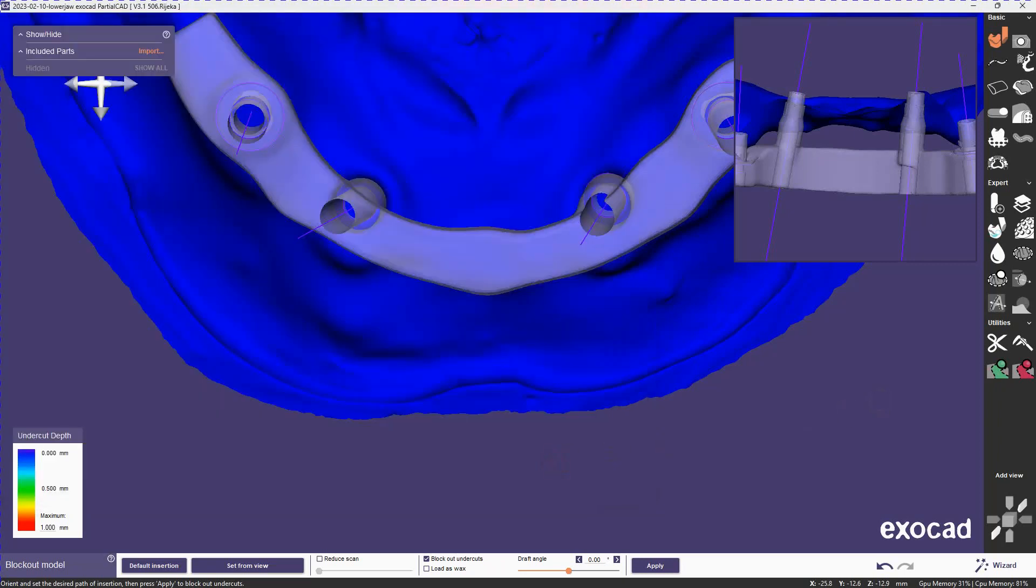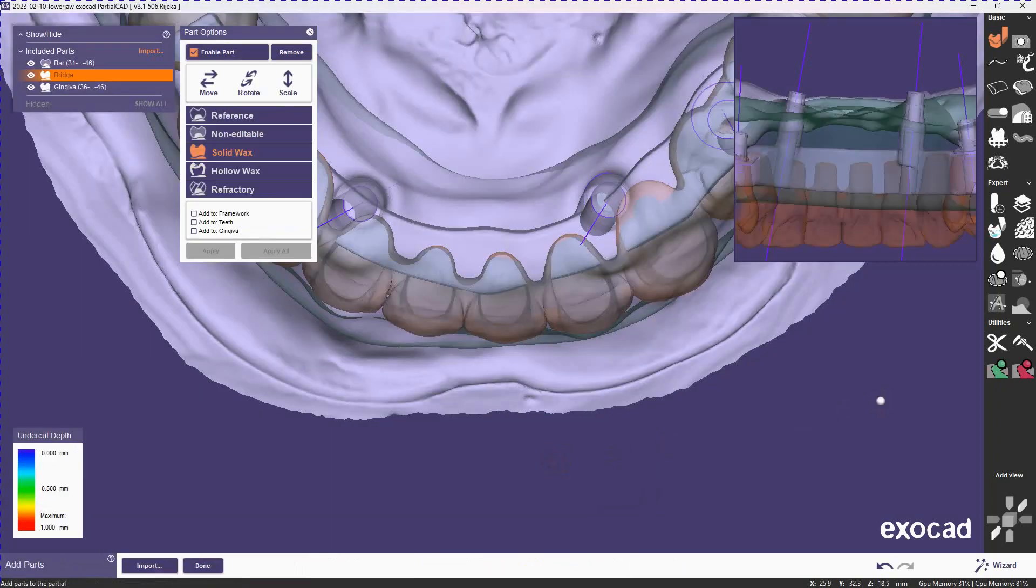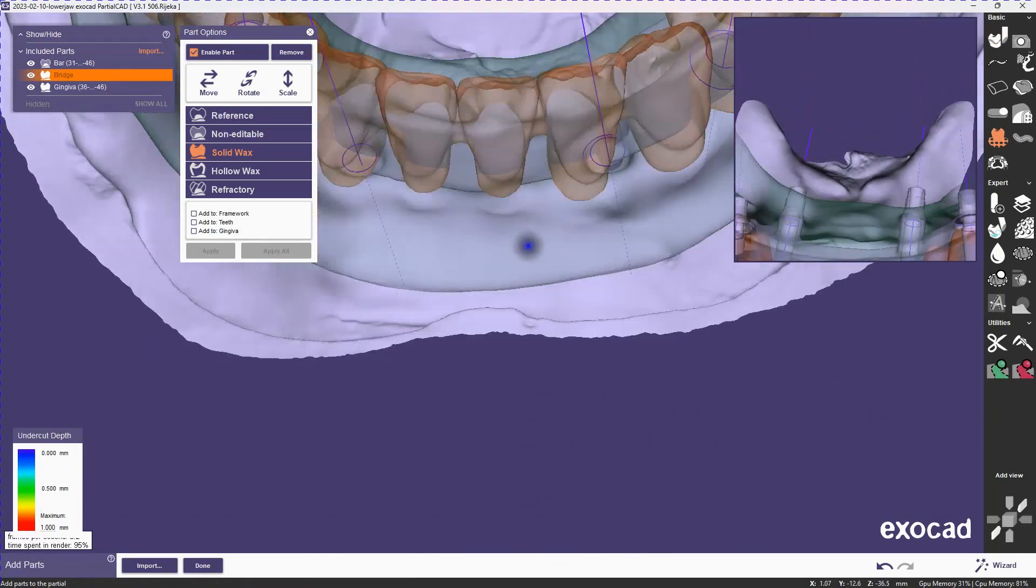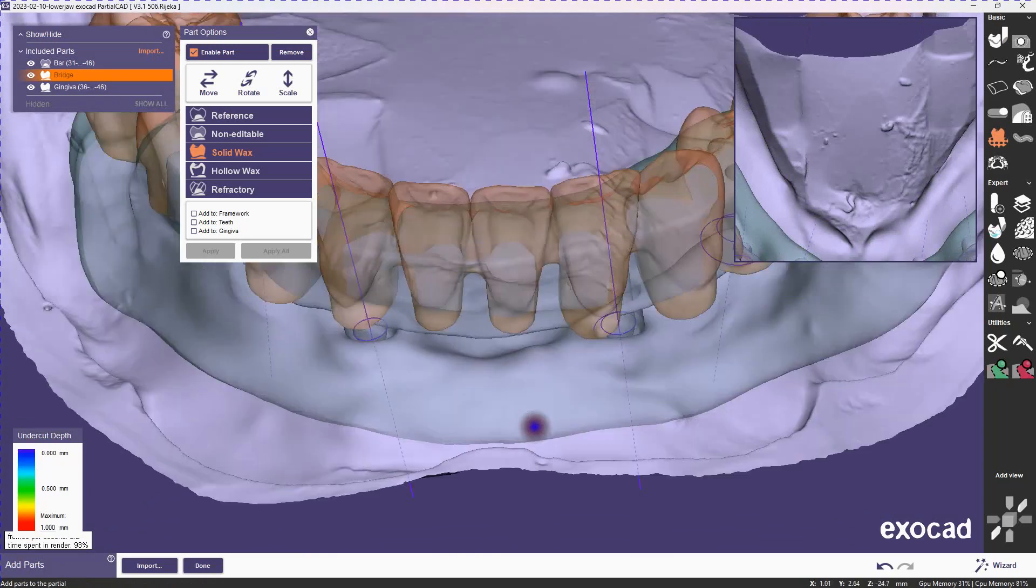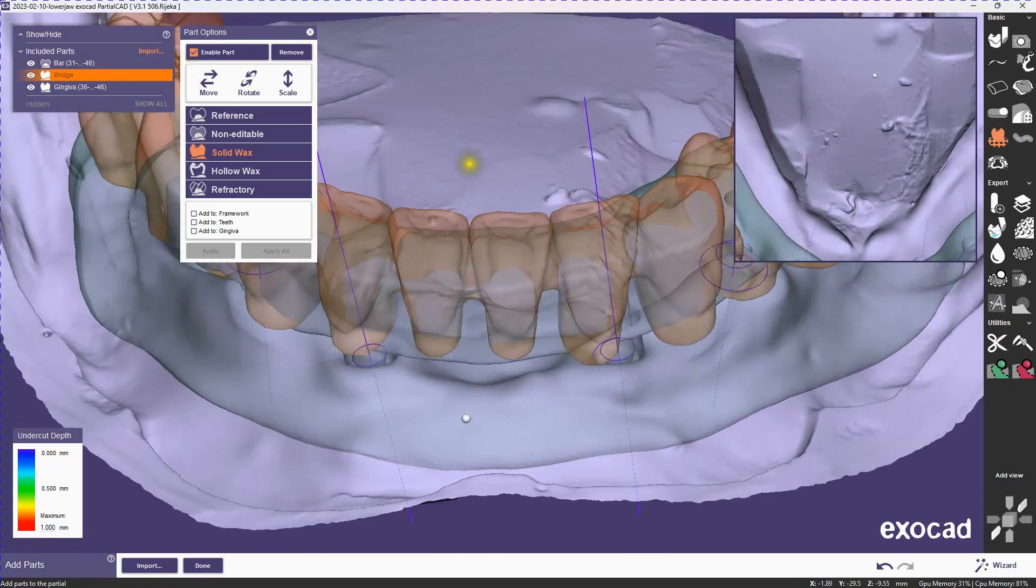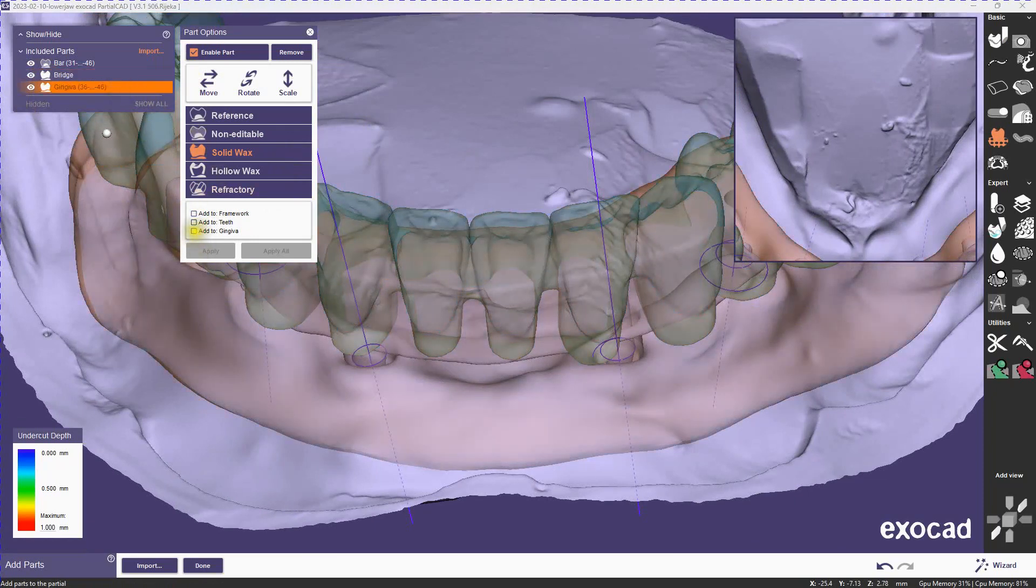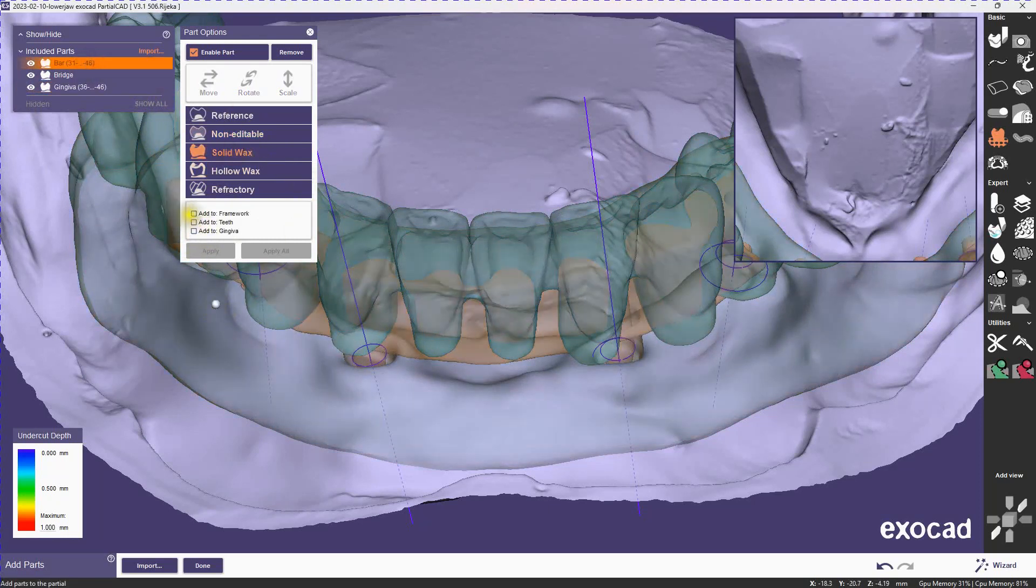Before we apply the block out step here we need to assign where these parts are going to go. This is important because the teeth are adapted inside of the gingiva. So we right click on our parts, make sure the bridge goes to the teeth, the gingiva goes to the gingiva wax volume, and finally the bar is going to be our honorary framework.